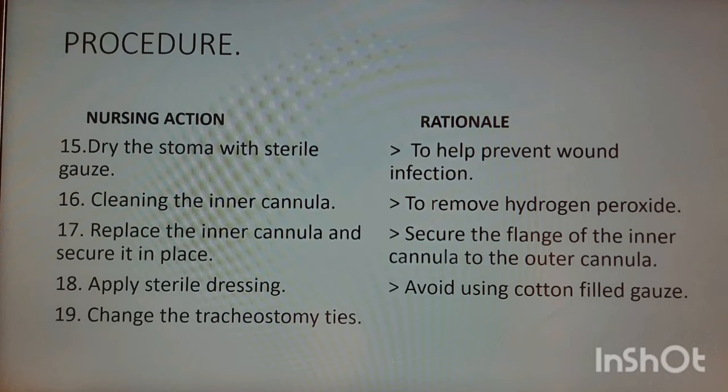Next, dry the stoma with dry sterile gauze. An infected wound may be cleaned with gauze saturated with an antiseptic solution and then dried. A thin layer of antibiotic ointment may be applied to the stoma with a cotton swab. It helps to prevent wound infection.